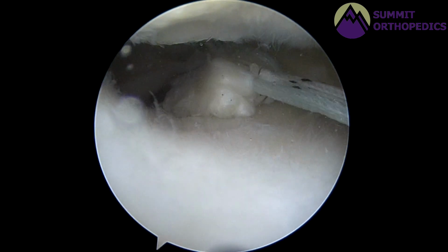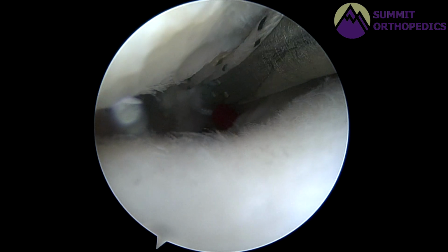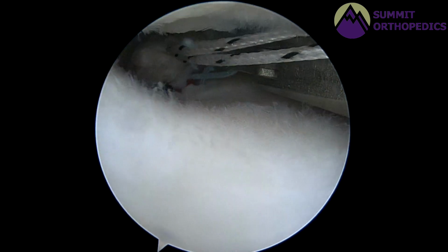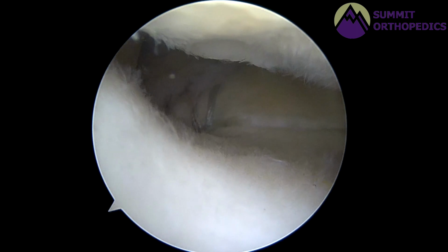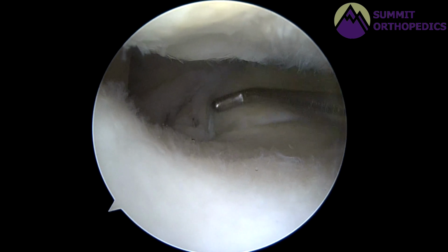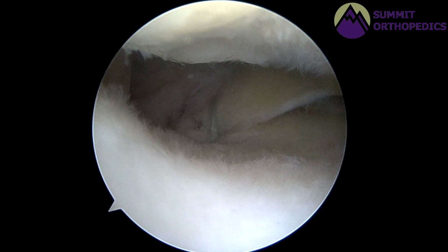I then pass another suture up through the tunnel that was created on the tibia. That blue suture is retrieved here, and that suture then allows me to shuttle the looped sutures through the base of the meniscal root into the tibia. And you can see now that with tension applied, with probing, that meniscus root is completely stable and secured to the tibia.